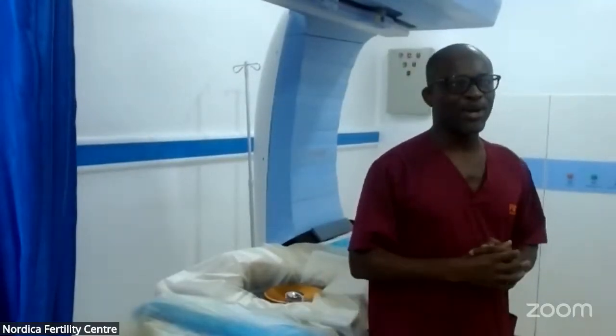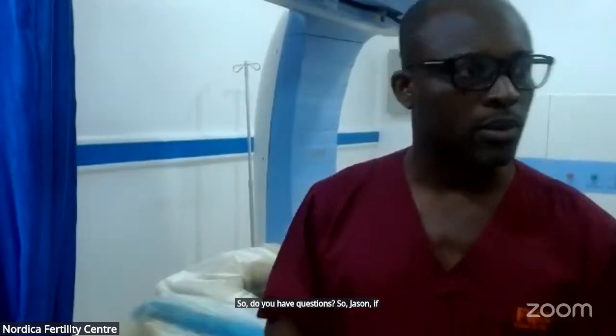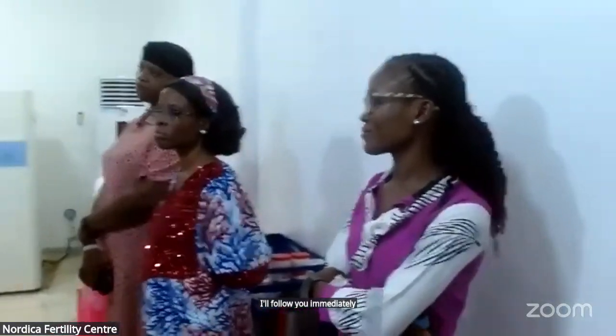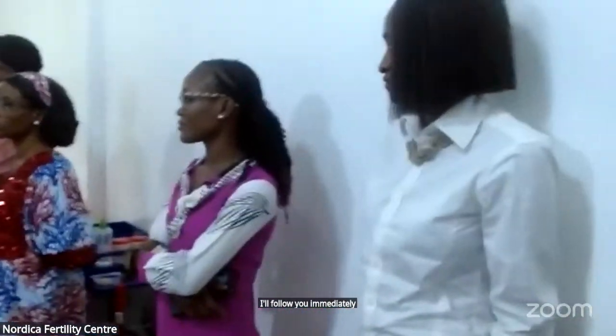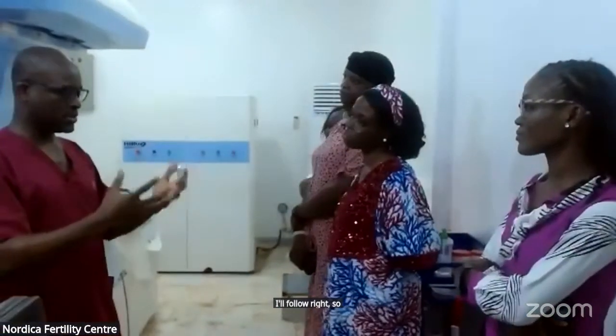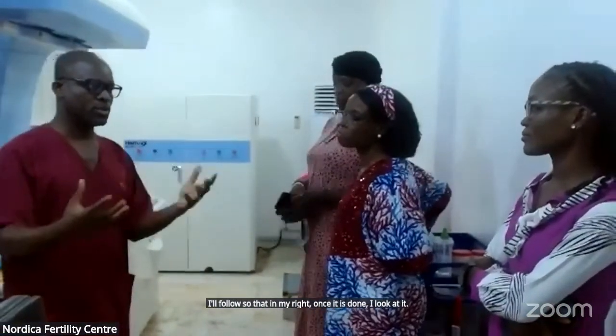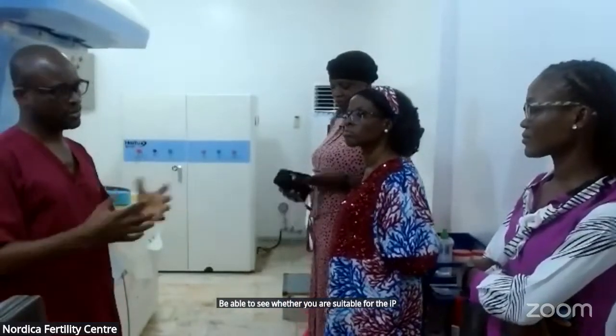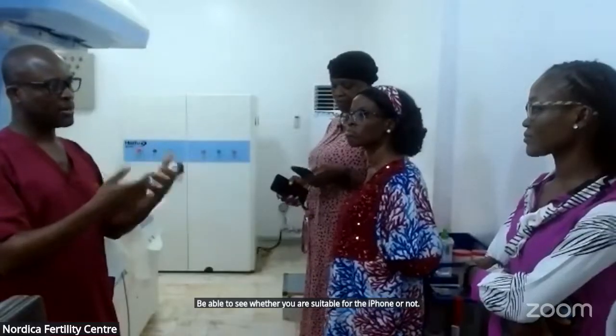Okay, so you said if role is modified, how can one be qualified for this? Yes, when you come in and we interact with you, take certain information from you, we ask you to do an MRI. Once it is done, I look at it and see whether you are suitable for the HIFU or not. So it is that MRI that we use.